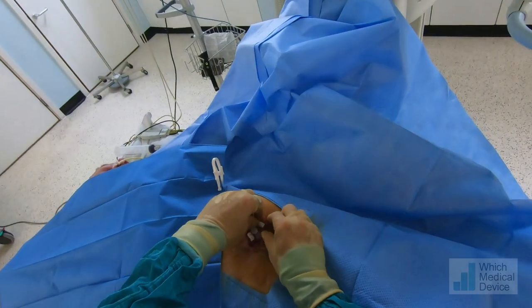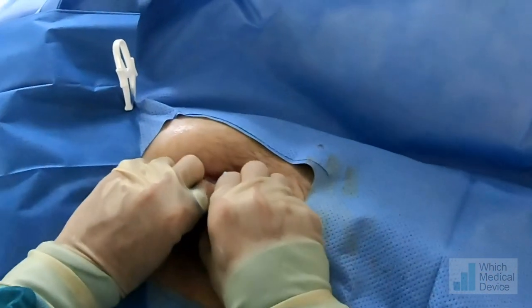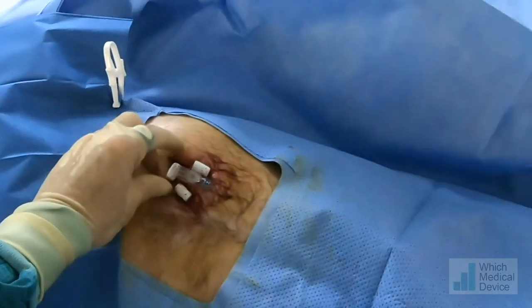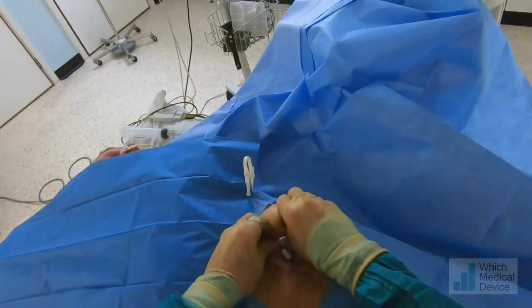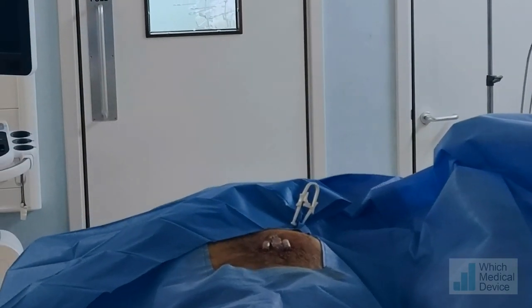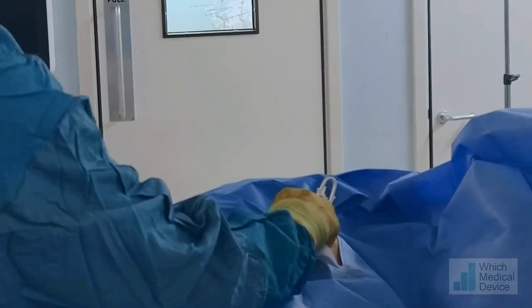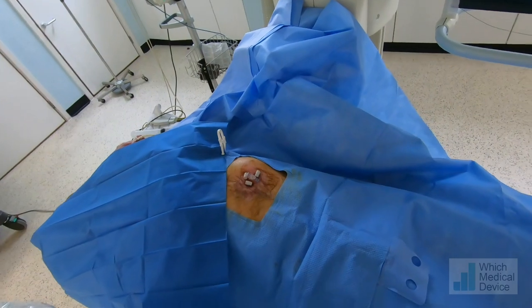Just at the end here I'm removing these little red retaining clips off the gastropexy, which means they can't be compressed and inadvertently released. These gastropexies stay in for the next 48 hours and don't need to stay any longer than that. And that's the mini gastrostomy in place.